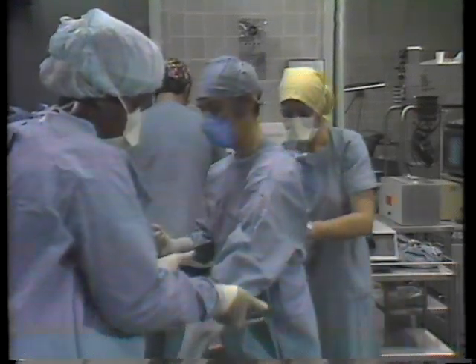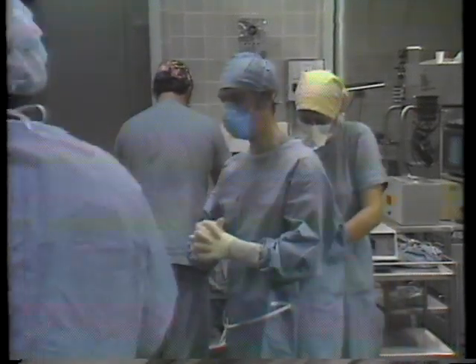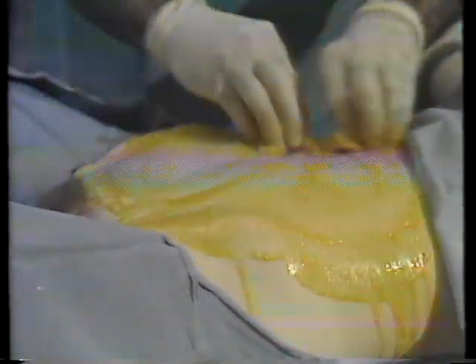Your doctor and his assistants will now prepare so the procedure will be performed in a sterile manner. The abdomen will then be cleaned with a surgical soap. Next, your vagina will be cleaned.